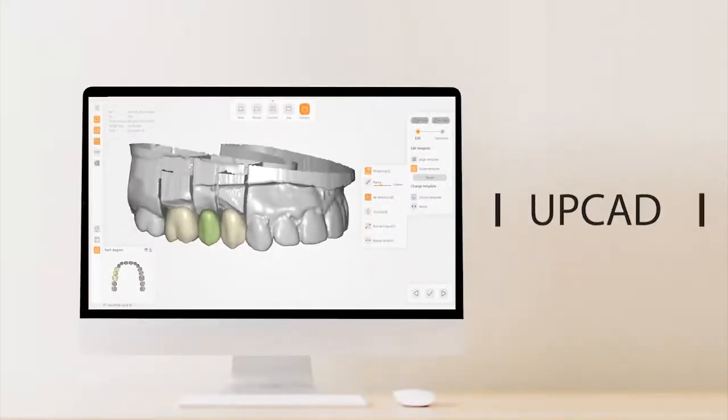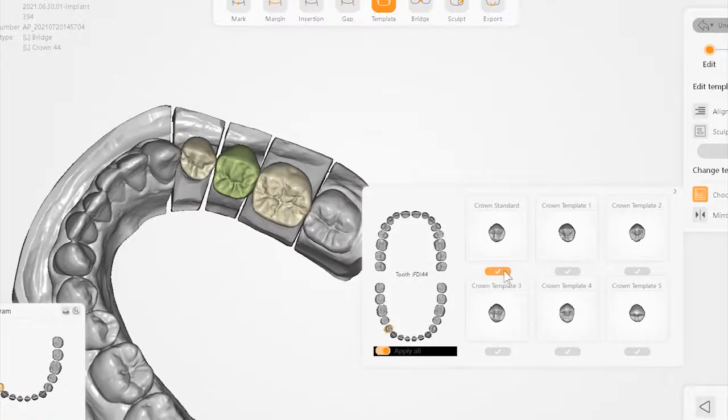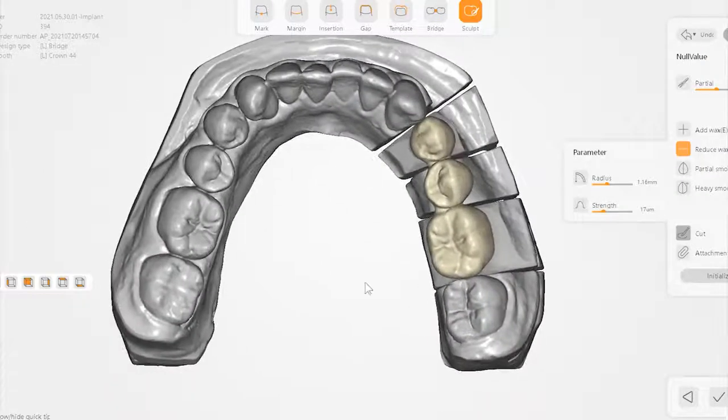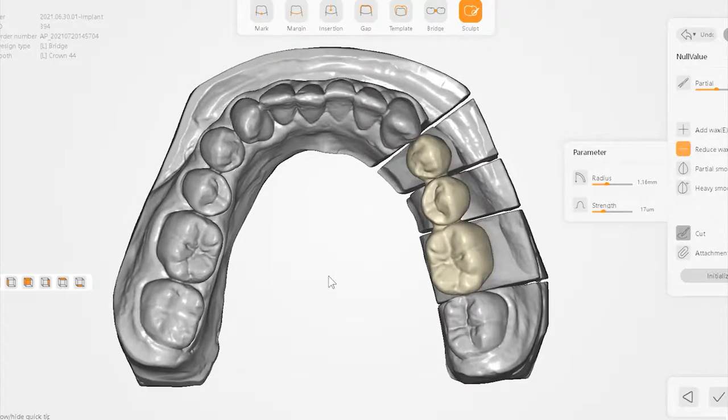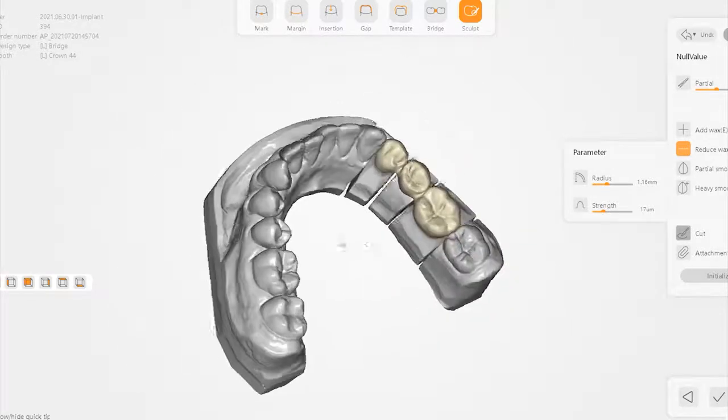UpCAD is a design software specially customized for dental technicians. It is easy to learn — design cases quickly and conveniently. You can select your favorite teeth from the model database in less than 5 minutes to complete a beautiful tooth design. We will launch the implant module next year, so please stay tuned.